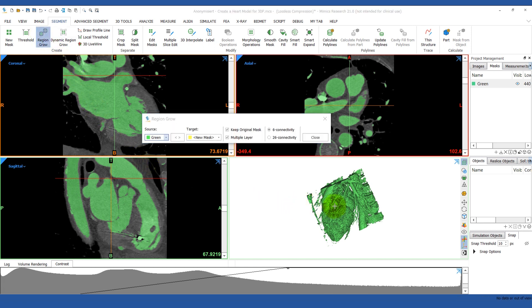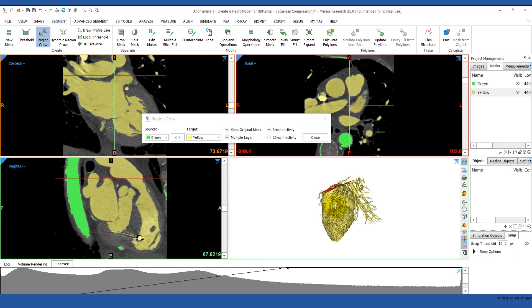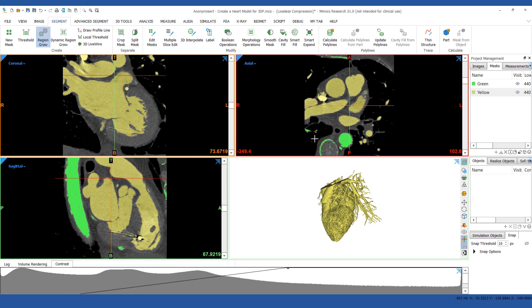Click on the heart and place a seed point. This will grow out to all the connected voxels. Now the new mask only contains the heart. If you're not as lucky and your mask still contains some unwanted structures, use the Split Mask tool to remove them.